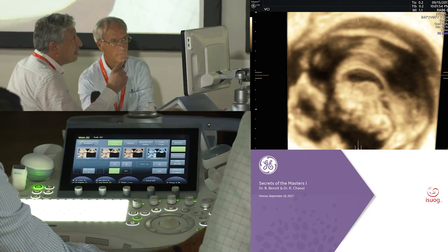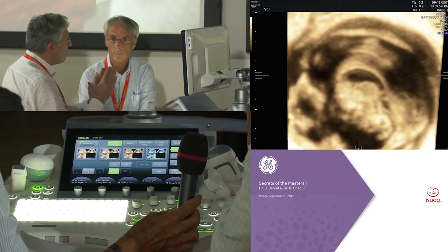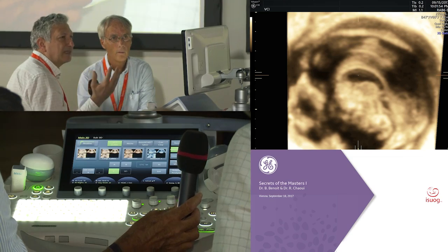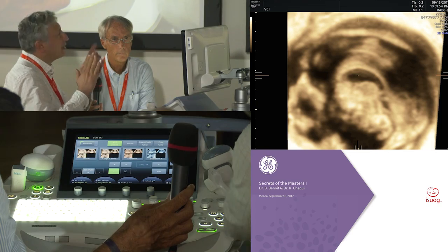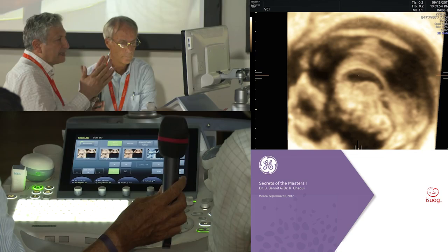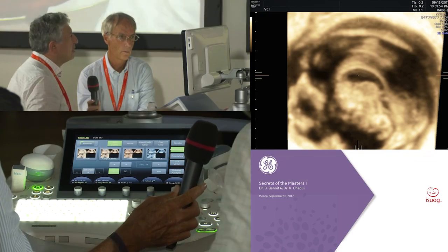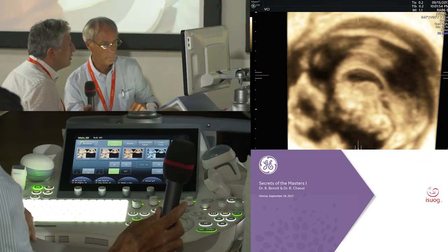And if you know that we are using not a middle way, but a sum of several planes, you will understand that the best view for corpus callosum is to acquire the volume bright. Because if you put the sum of several images and you are already dark, you will not see anything. So before acquiring the volume, if you want to use this technique, you need to take a bright volume so that the sum of several planes will not be very, very dark. So this is a good secret. This is the way I do it.